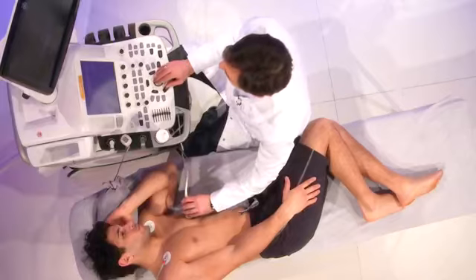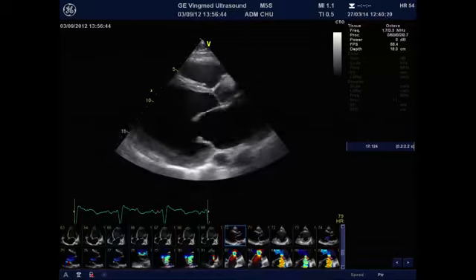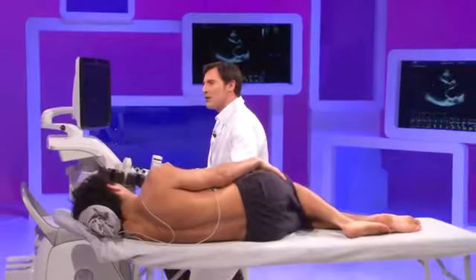If you would like to examine the severity of secondary MR, you need to assess the mitral regurgitation in three different steps. First, you look at the valve, and let me take again the parasternal long axis view, where you have the morphology of the valve that is completely deformed due to the traction by the papillary muscles that are displaced and distorted due to the left ventricular dilatation. This kind of mitral regurgitation relates to two different things: an increase in tethering force and a decrease in mitral closing force.